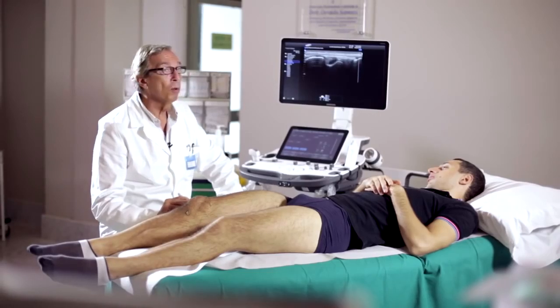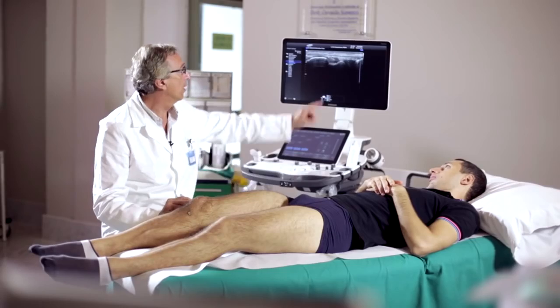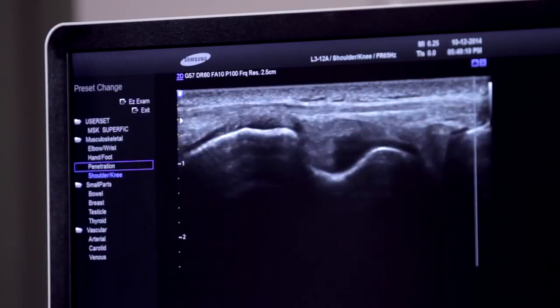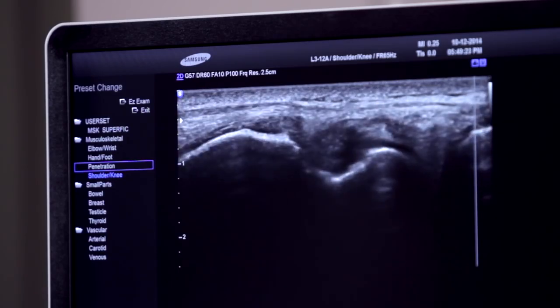This scan also allows us to recognize some very important structures, such as the presence of these uniform irregularities of the bone surface that represent the popliteal hiatus, where the tendon of the popliteus muscle begins. Another very important structure is the distal tendon of the biceps femoris, that is localized contiguously and superficially with respect to the lateral collateral ligament.